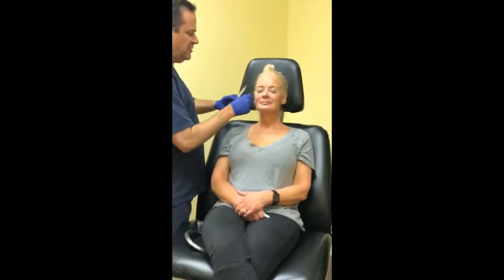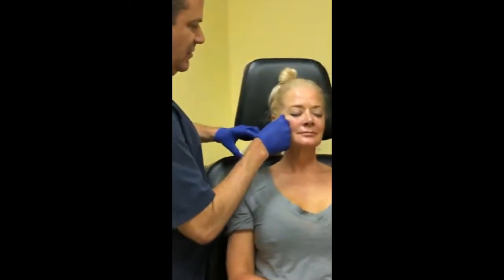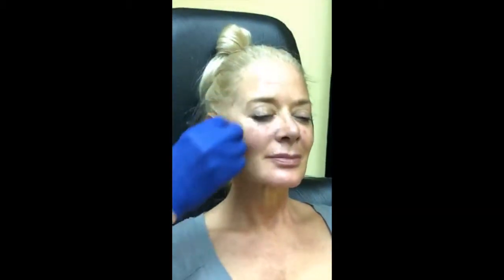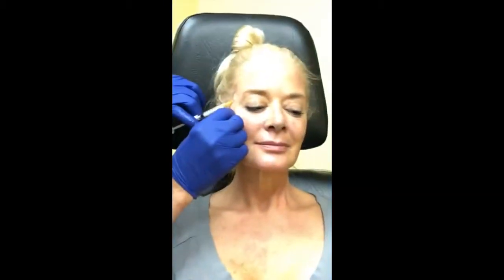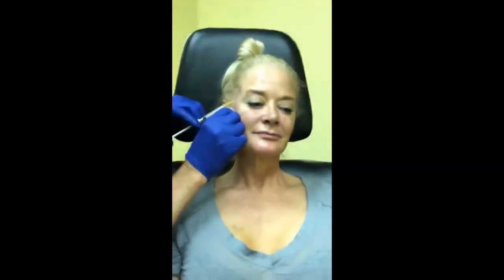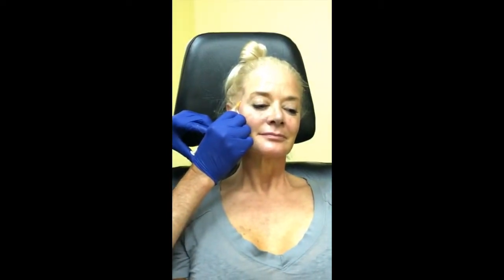We'll start at the top and work our way down. Starting in the temple here — she has just a little bit of hollowing, probably not going to take a whole lot to smooth this out. It doesn't take much. One of the things I like about Belafill is you get a lot of correction for a little bit of product.